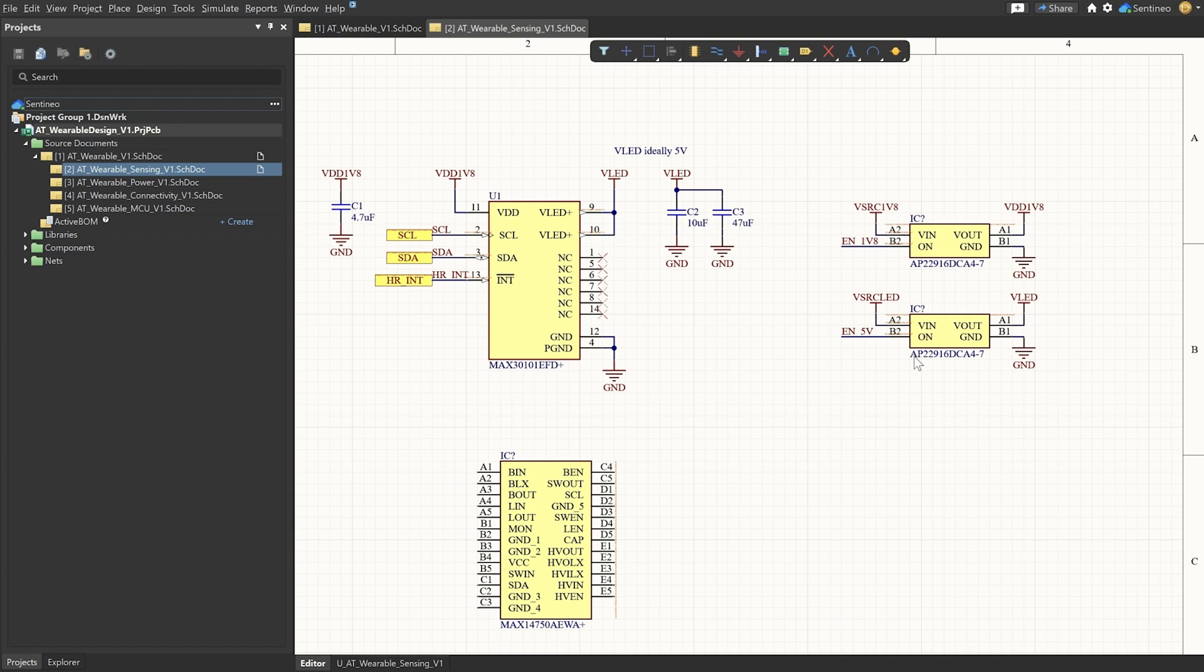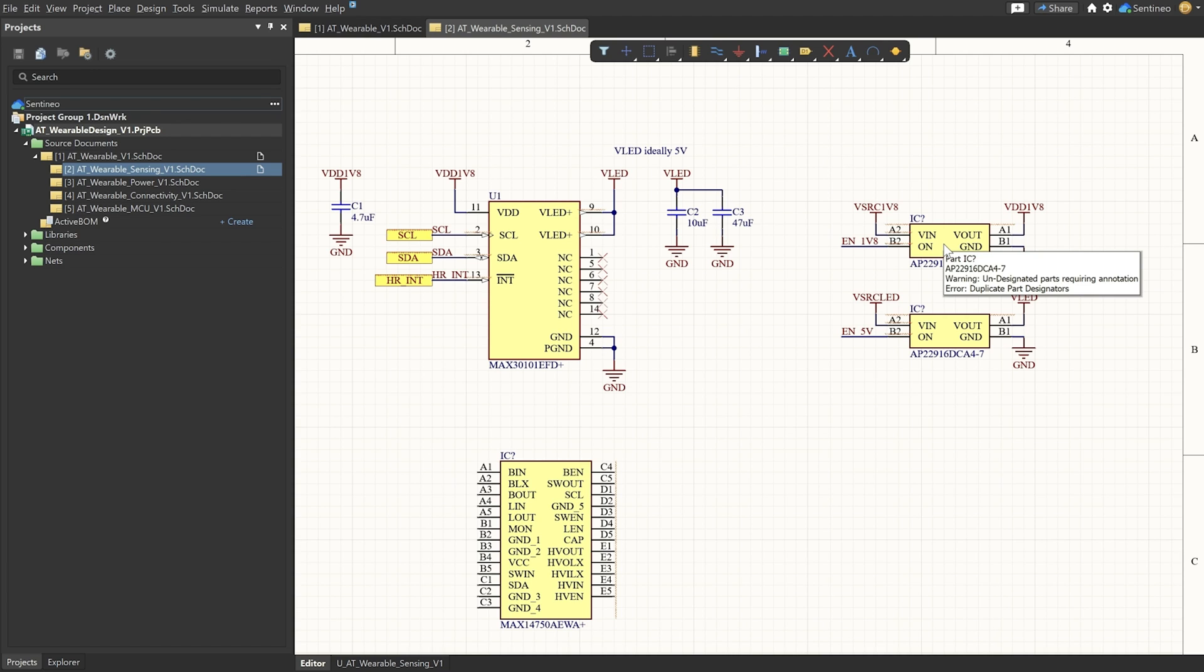So in the datasheet, it's mentioned that you can, via firmware, via an I2C command, put the system in sleep mode. It's still drawing 0.7 microamps. Now, if you really want to have 0 amps being drawn, then you can use these load switches. I've put two load switches in here. These are very small ones, BGA load switches. So in terms of footprint, it will not hurt our design. But then we really have granular control on the 1.8 volt and 5 volt supply.